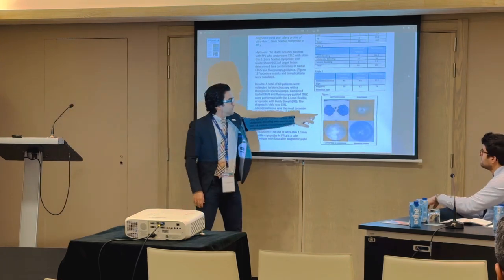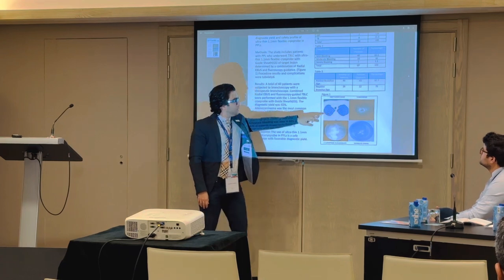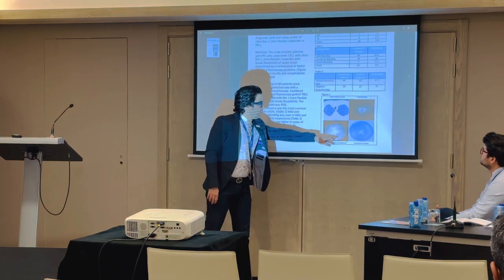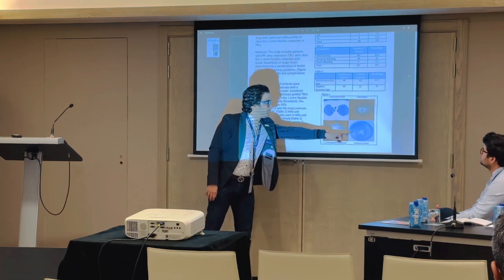Here you can see, for example, this is the lesion — it's a sub-segmental lesion. This is the image on the radial probe, confirmed on the fluoroscopy. The radial probe is removed, and with the same guide sheet, the 1.1 cryoprobe is introduced and a sample is obtained.